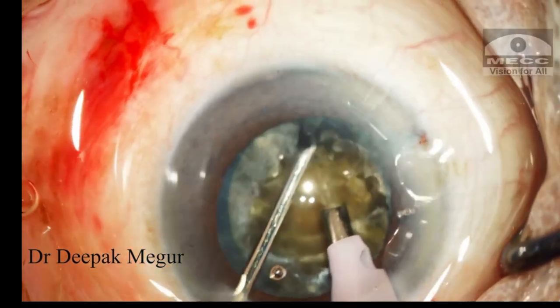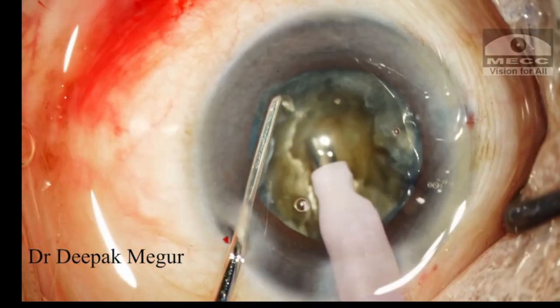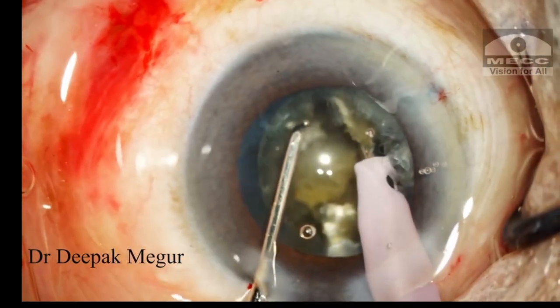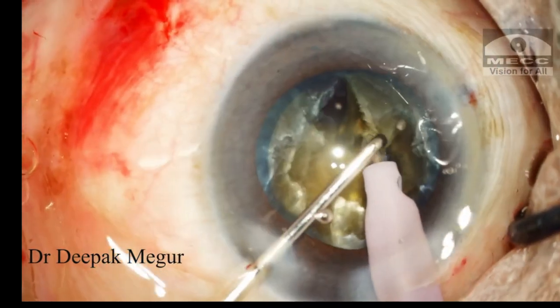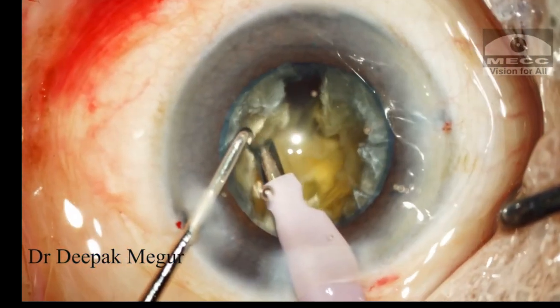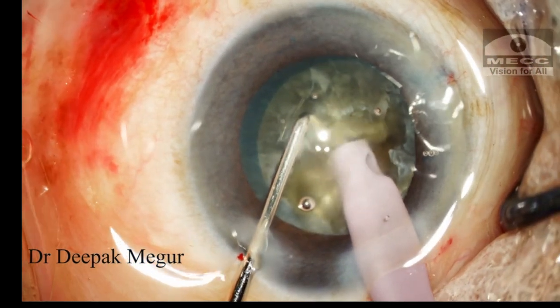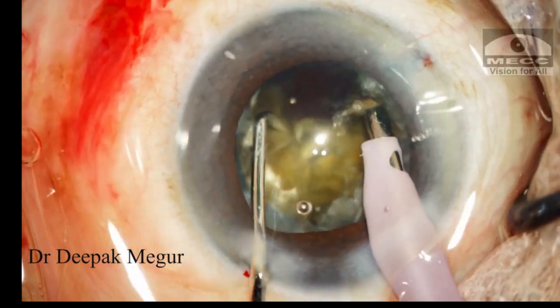After the third chop, I'm getting one of the quadrants out of the bag and then consuming it. The idea is to create some space in the bag, which is helpful in such cases in which the nucleus invariably would be large and bulky. The chopping is continued in a similar fashion until I have many smaller fragments which are easier to consume.